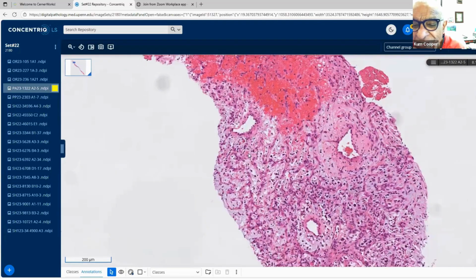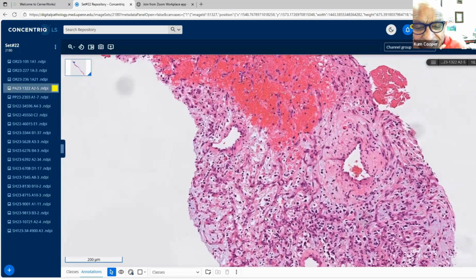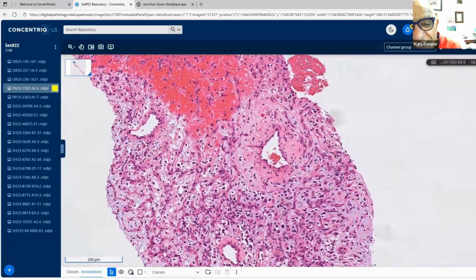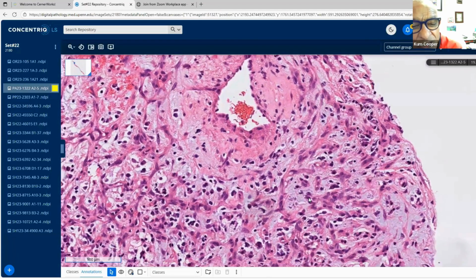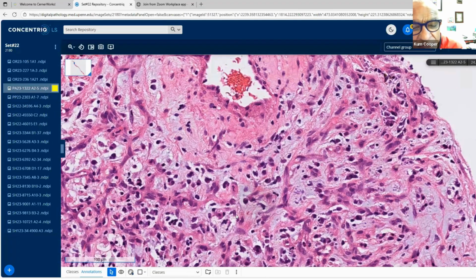I just want to show you higher power where you can see this intense vascularity, interconnecting vascularity. And then here you can see this myxoid matrix. Now, many of these cells here, and I'm going on high power deliberately just to show you between the vessels forming this interconnecting pattern, if you will. You can see these plasma cells and lymphocytes. So these are inflammatory cells in between.